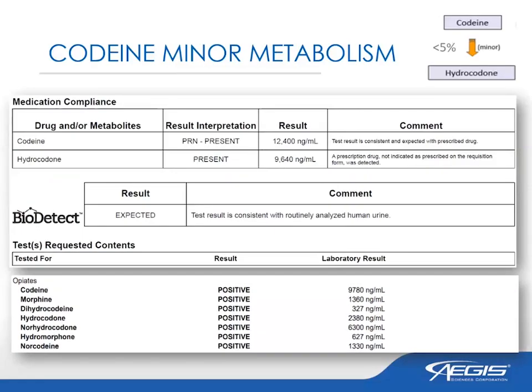The lab report in this slide demonstrates a total hydrocodone concentration, which is 77% of the total codeine concentration. This concentration is greater than the 5% of the codeine, which defines this hydrocodone as a separate ingestion, as it is indicated in the medication compliance box at the top.